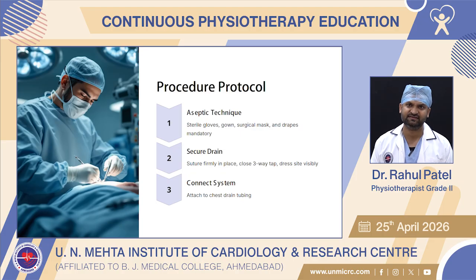Procedure protocol, aseptic technique. First, sterile gloves, gown, surgical mask and drapes are mandatory. Second, secure the drain suture firmly in place, close the three-way tap, dress the site visibly. Third, connect the system attached to the chest drain tubing.